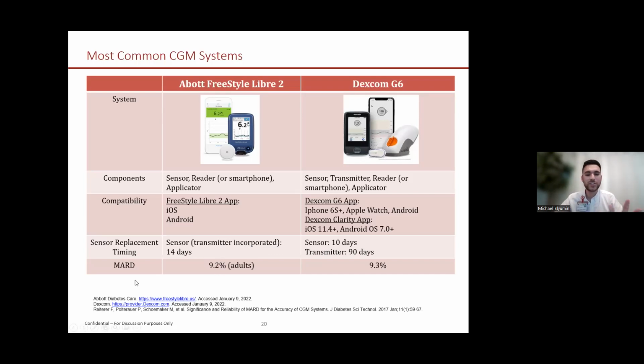The MARD, this is a score of how accurate the system is compared to a reference standard, which is a glucometer. And the 9.2% is in line with other glucometers. So these are FDA approved, and they are on average shown to be equally reliable to other systems such as traditional glucometers.